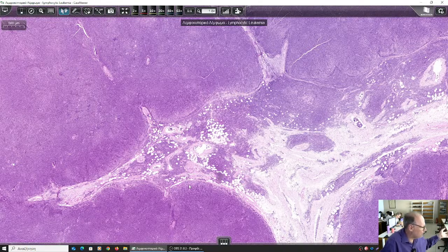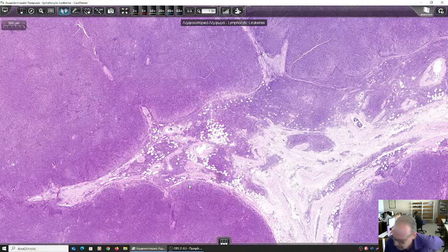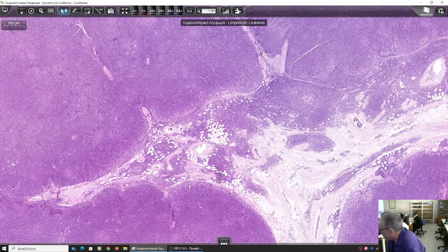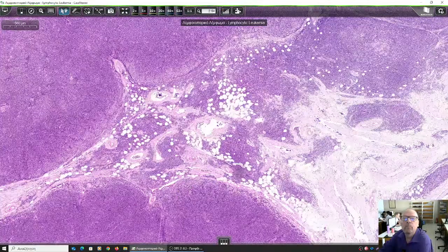What do you see here that disturbs you? What do you think? We mentioned it in the previous lymphoma, but there it was not clear enough. Here it is clear, fortunately, so that we won't miss the diagnosis. Who can tell me what you see here?